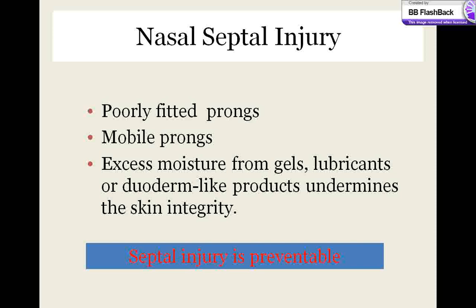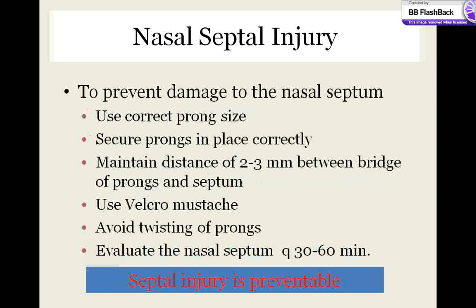Creams and gels used to protect the skin itself cause excessive moisture locally, resulting in breaking of skin integrity, which results in further skin injury. A Tegaderm along with special cannulaid helps in protecting skin of septum and surrounding area.